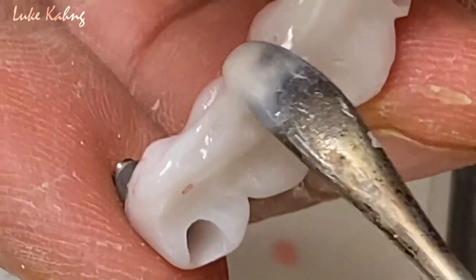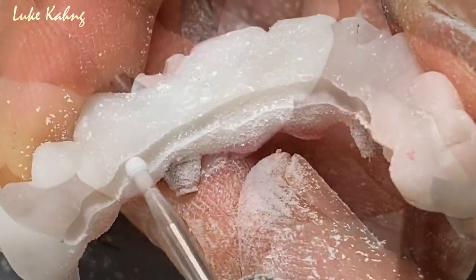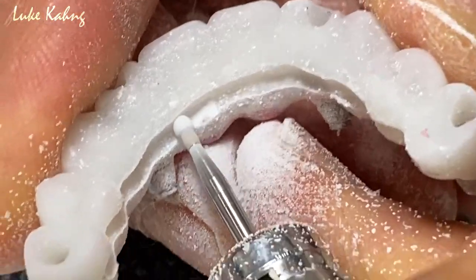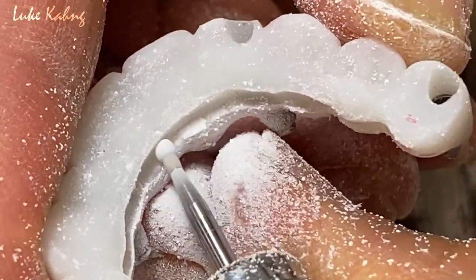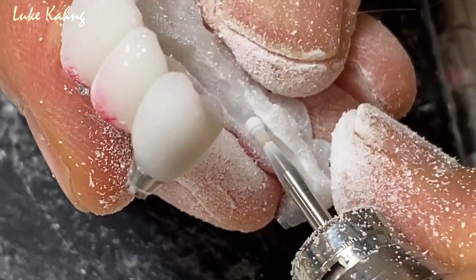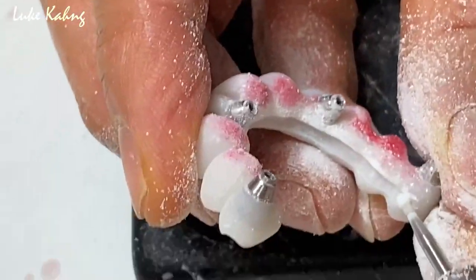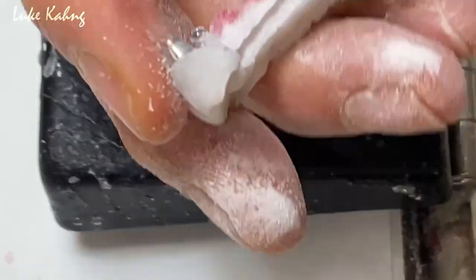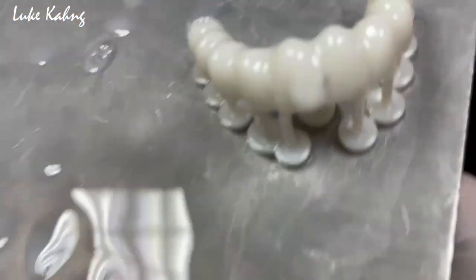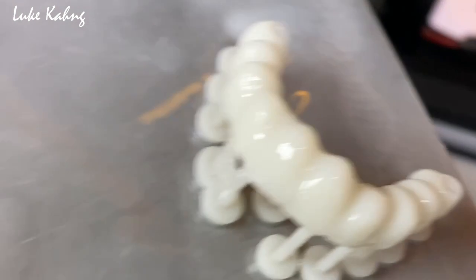So now we add the acrylic after putting the wire. This one is the temporary implant case — it's just out.